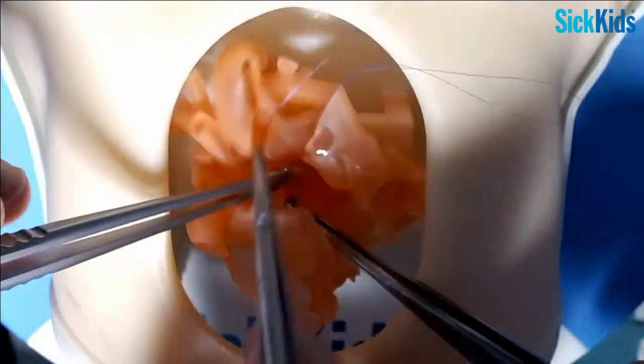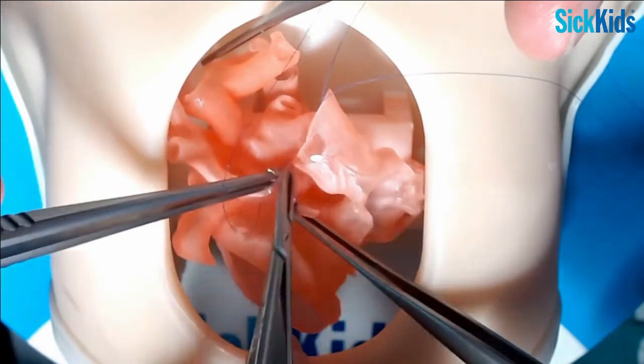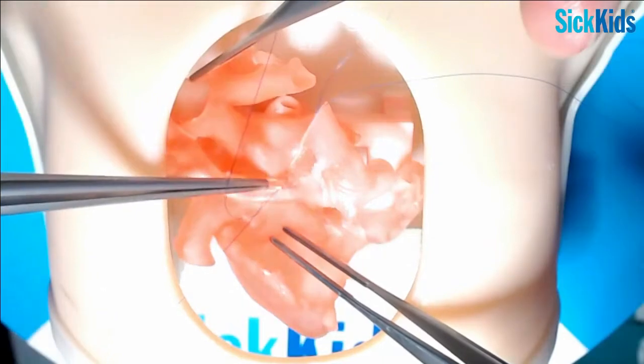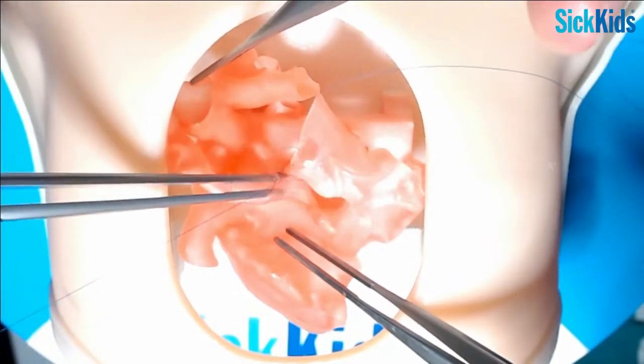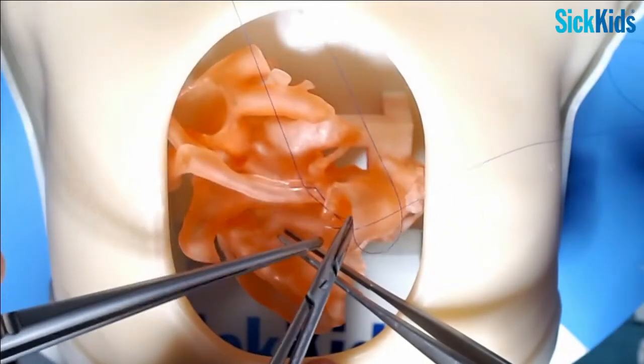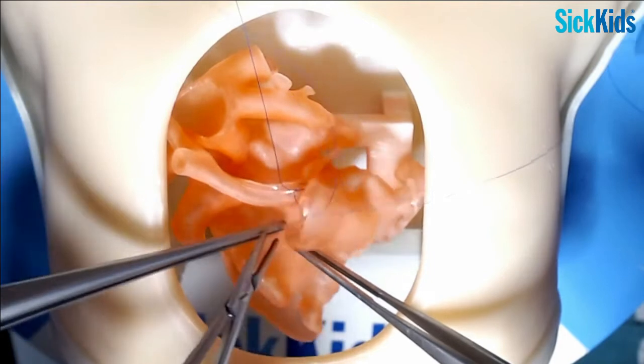Let's get that out of the way. And one of the things you can do once you get this together is you can look down inside like this and see the orifices of both coronaries to make sure that you haven't compromised them in any way.